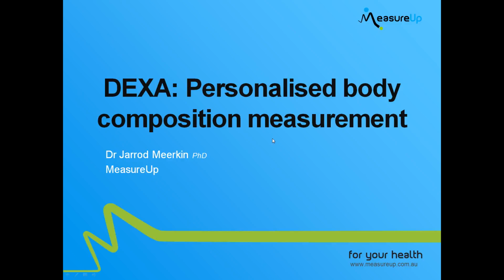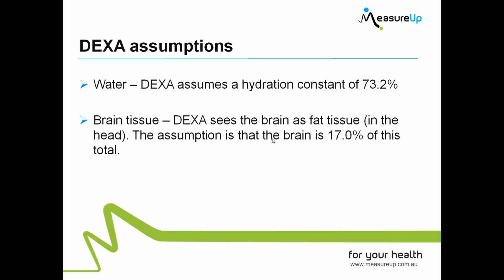This presentation will assist you in understanding your scan report. DEXA makes various assumptions about the body. Two of the important ones are the water and brain tissue.